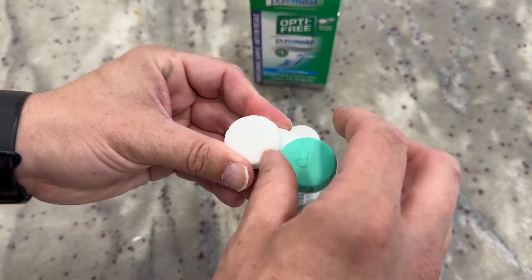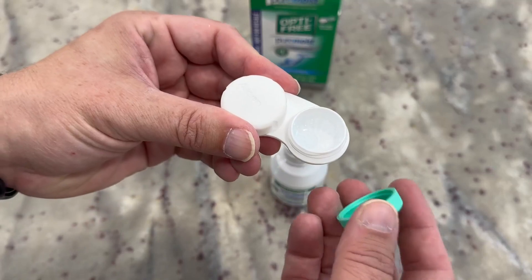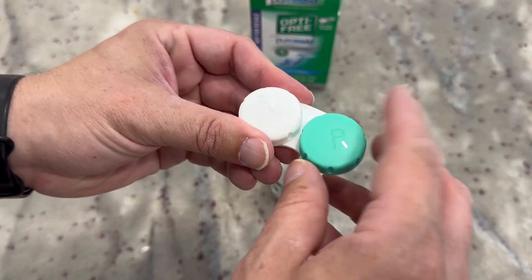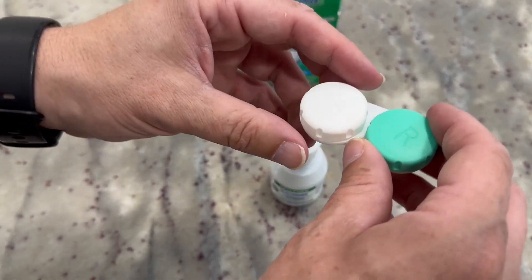In here you can see we have a little bit of the solution in already, as well as a contact hanging out in there. It's just a good clear solution — keeps your contacts clean and helps make it easier as you're getting them in and out. Just clear moisture in there.